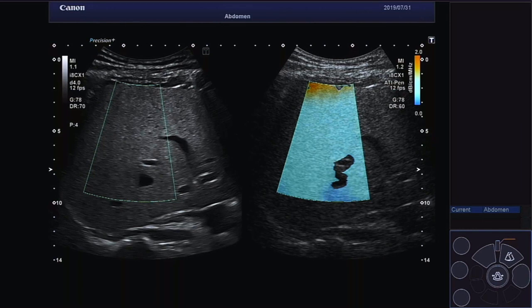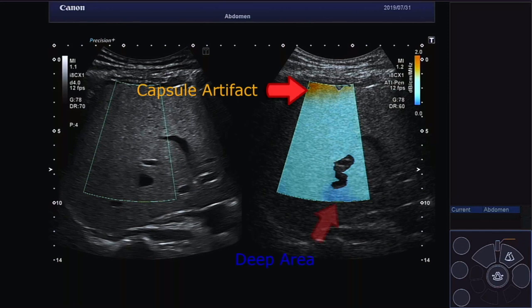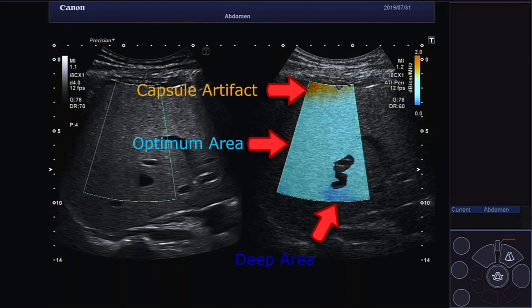It is recommended to use a window size as large as possible. We can identify three colors in the window: orange, which represents the capsule artifact; dark blue, indicating deep areas where the noise level is too important for a reliable measurement; and light blue, the optimum area for liver tissue assessment.